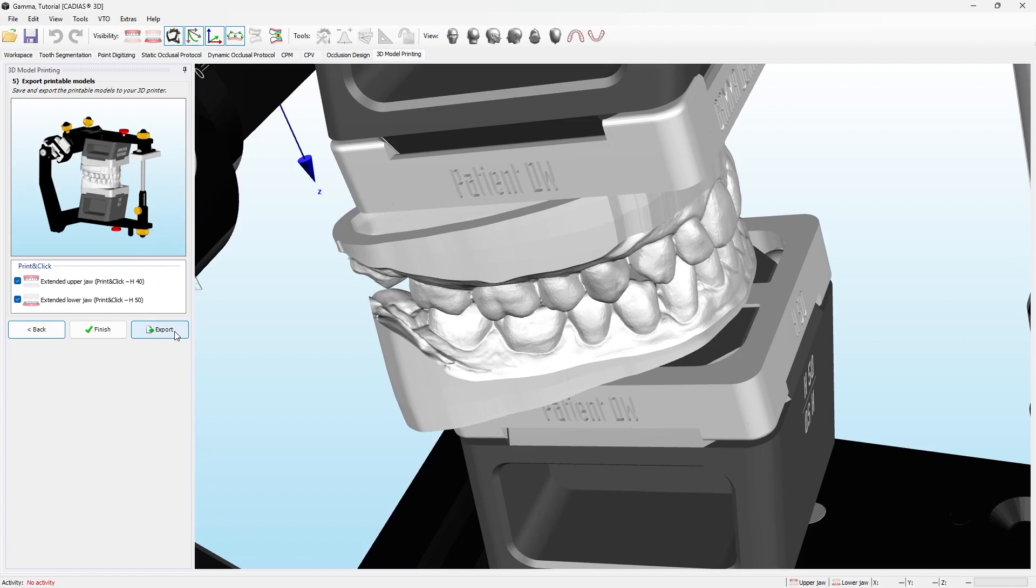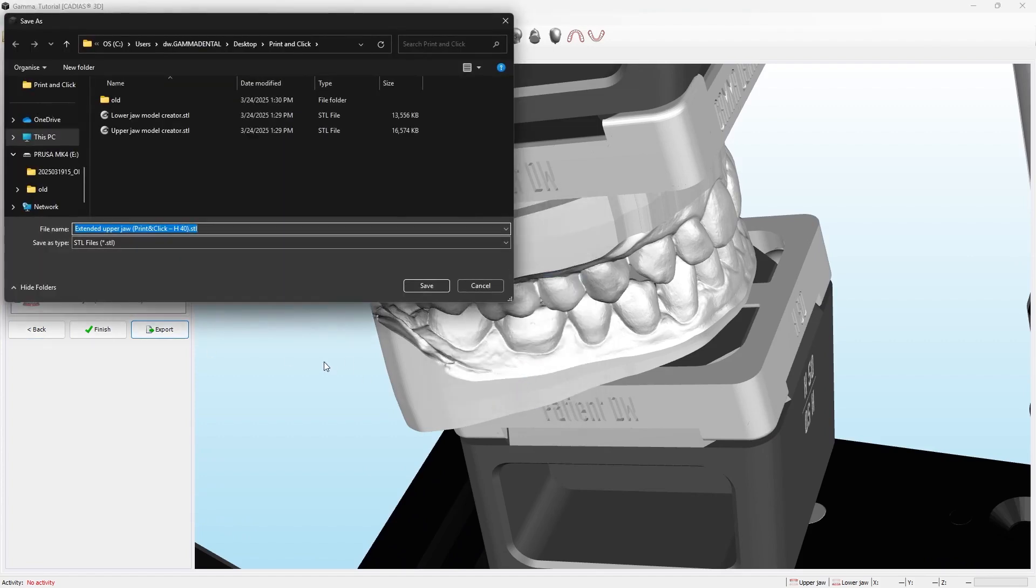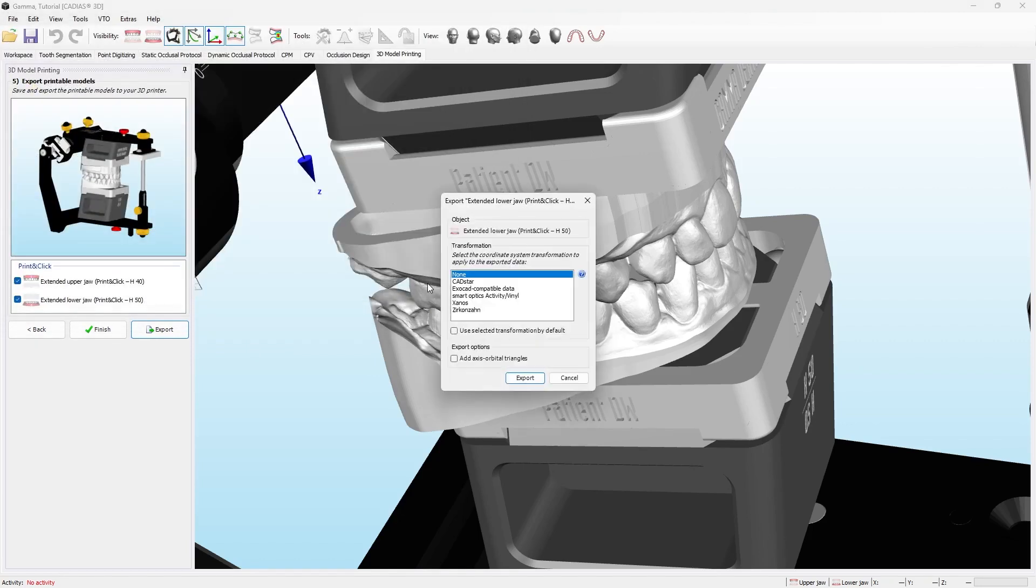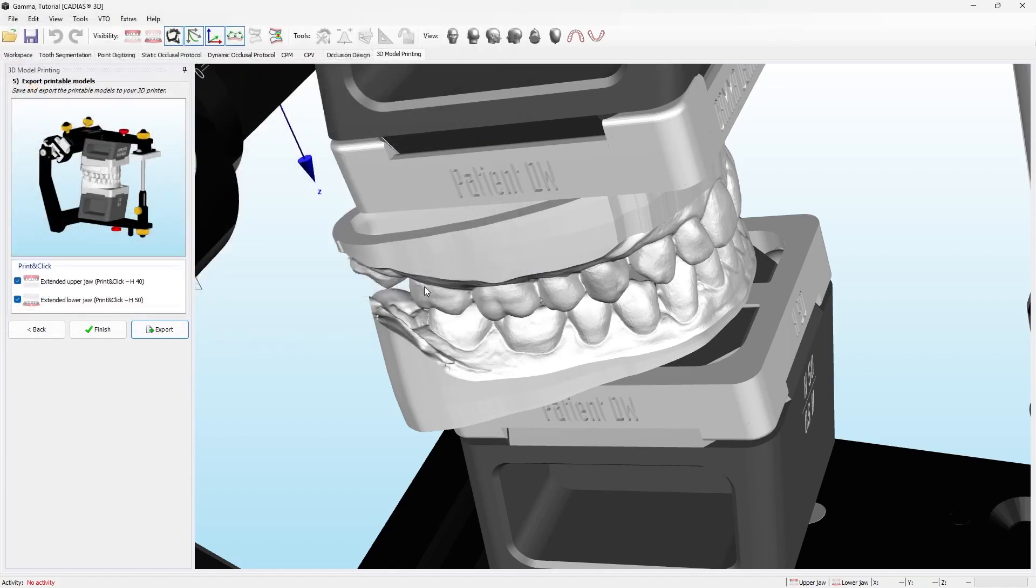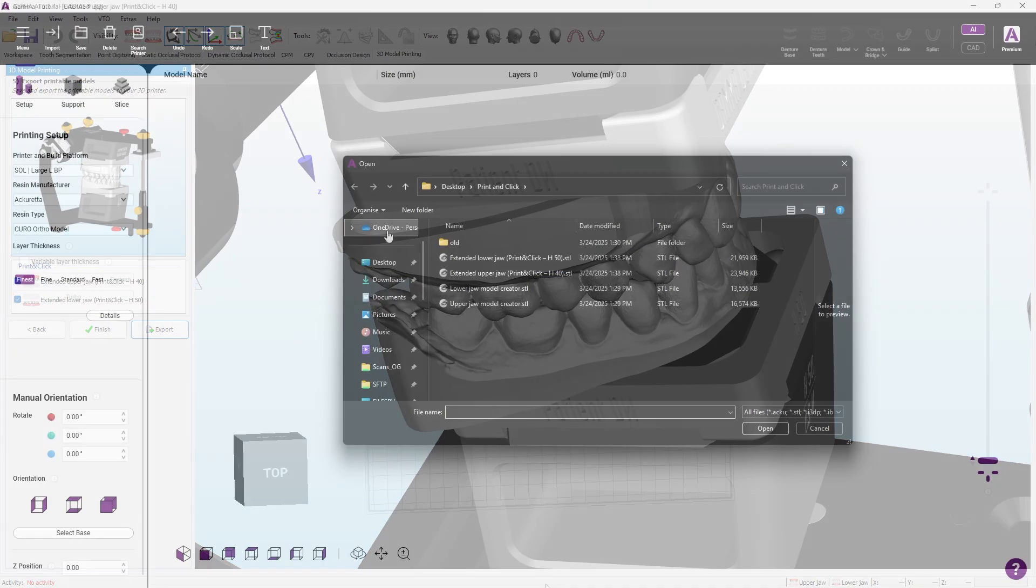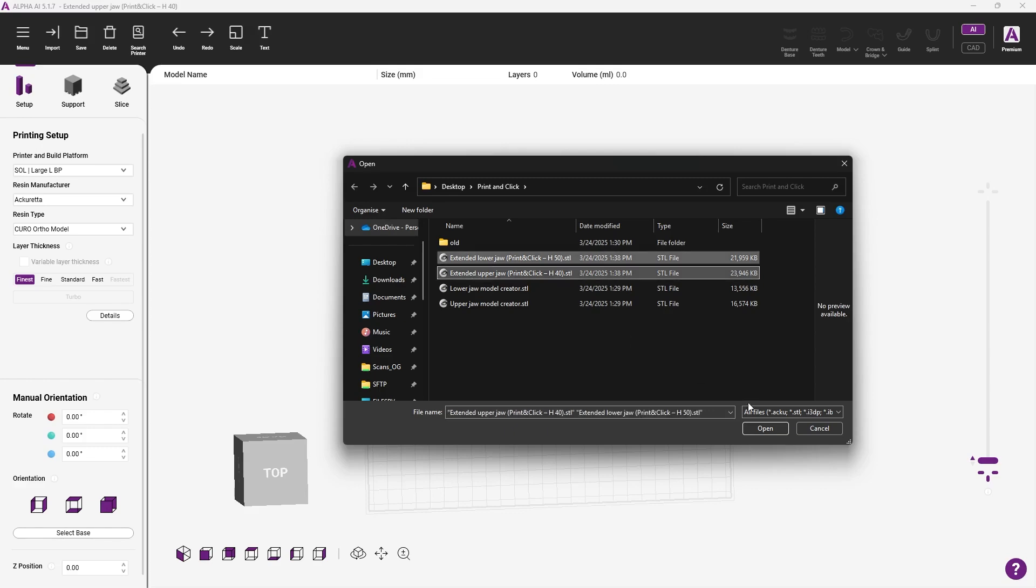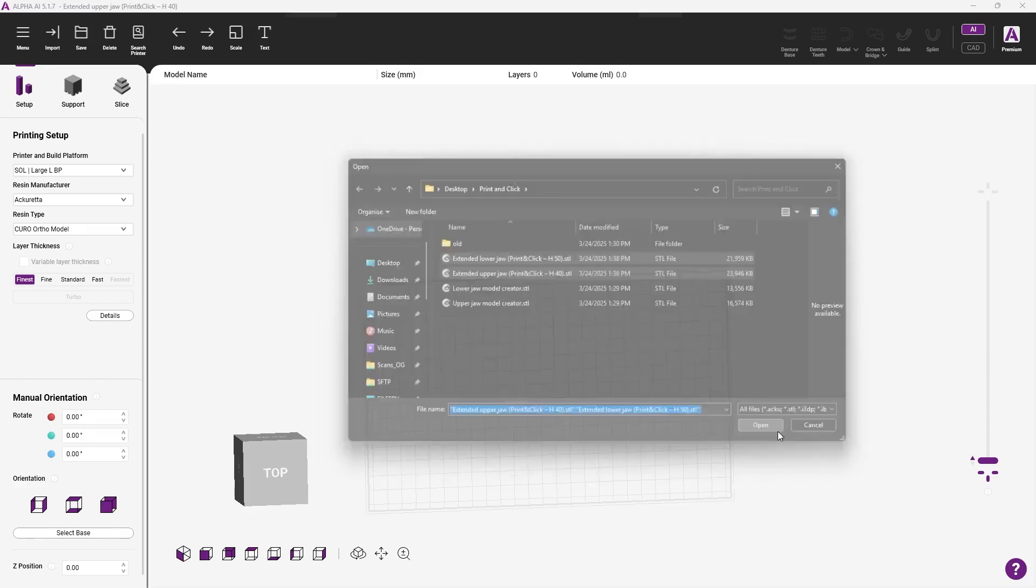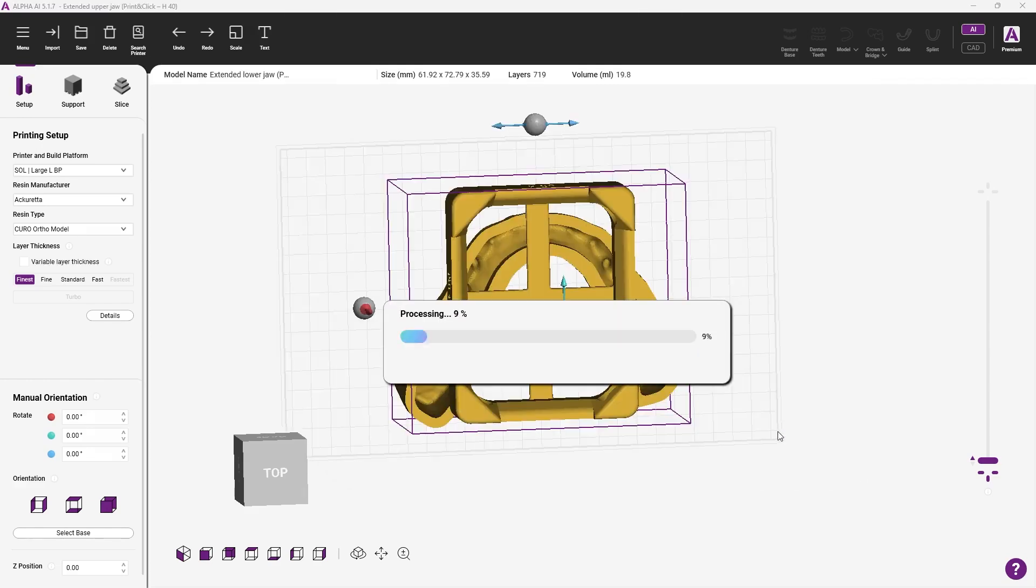Now you can export the models. Import the models to your slicer. The baseplate should face the print plate.